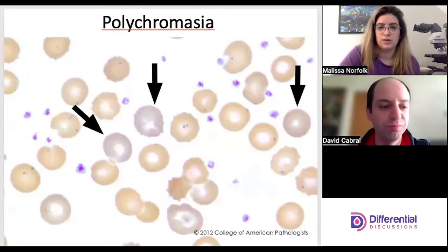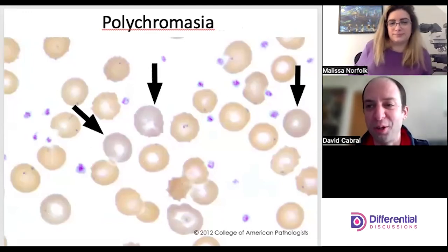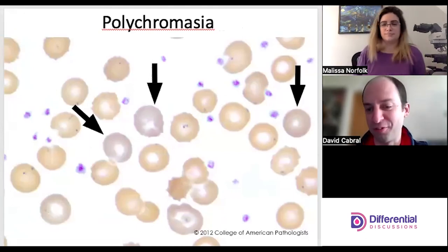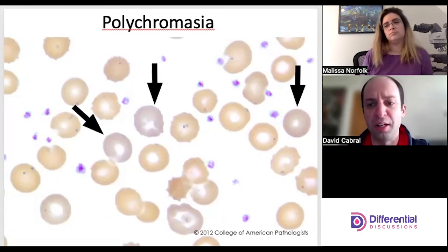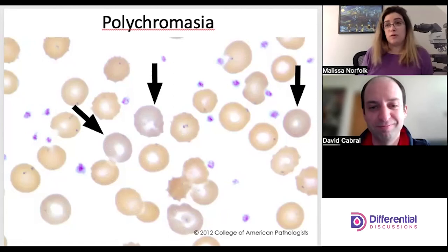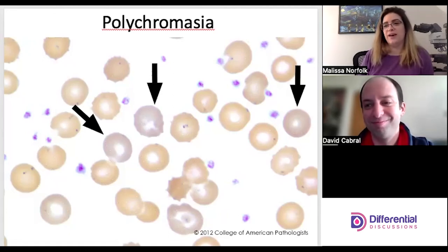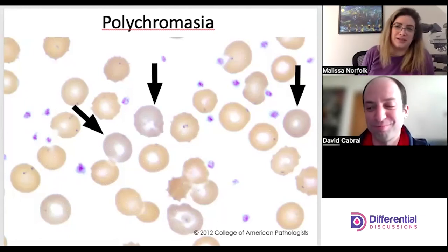Polychromasia — multiple colors in our cell. A little blue and a little red gives this purplish color. These generally represent shift reticulocytes — stress reticulocytes put out when recovering from an anemia. Polychromasia is classically overcalled in my experience. Stick to your institution's grading schema — whether it's five to ten per field or one to five per field — and only call what is consistent across the peripheral blood smear, not just one field.